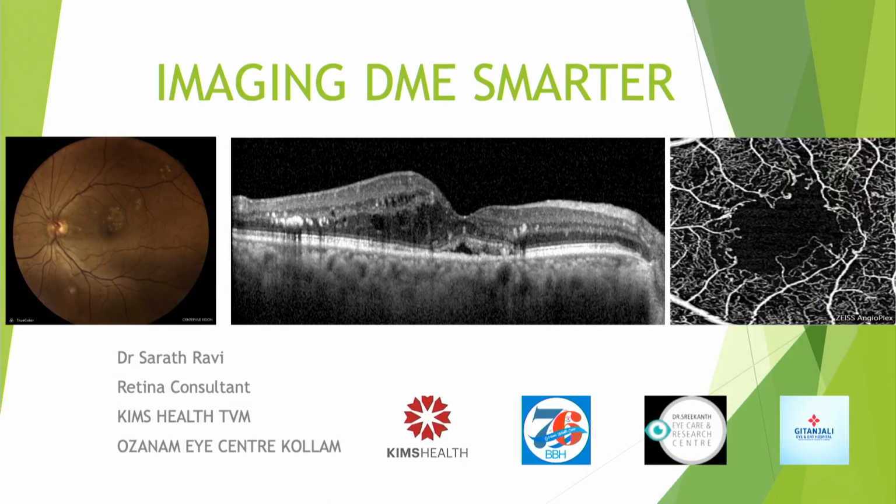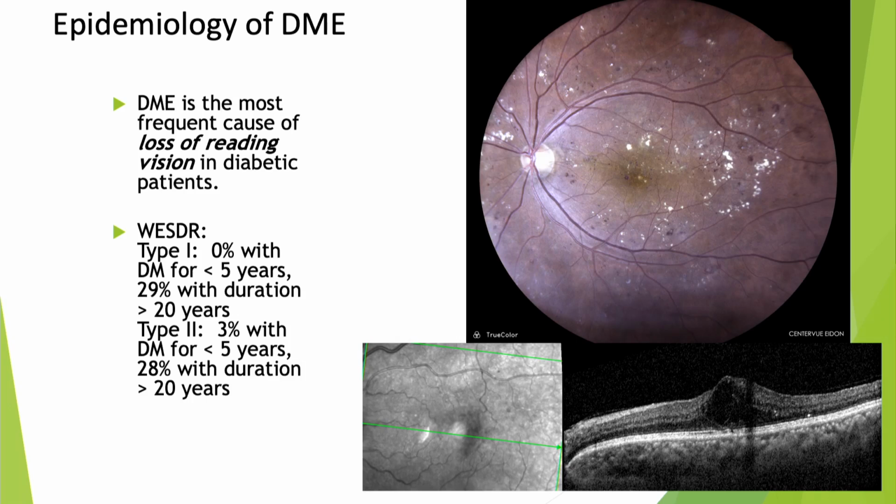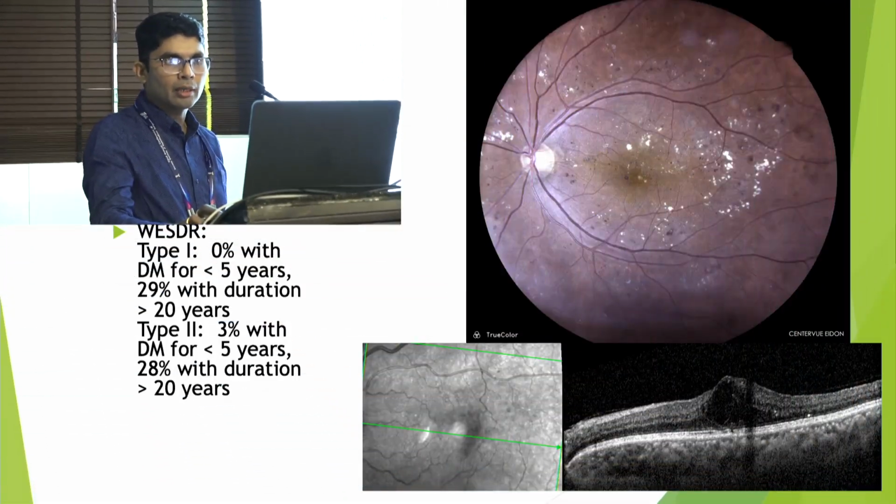I'll be talking on diabetic macular edema, how OCT helps in imaging. Diabetic macular edema is one of the most frequent causes of reading vision loss, and among patients with more than 20 years of diabetes, almost one third have some form of diabetic macular edema.